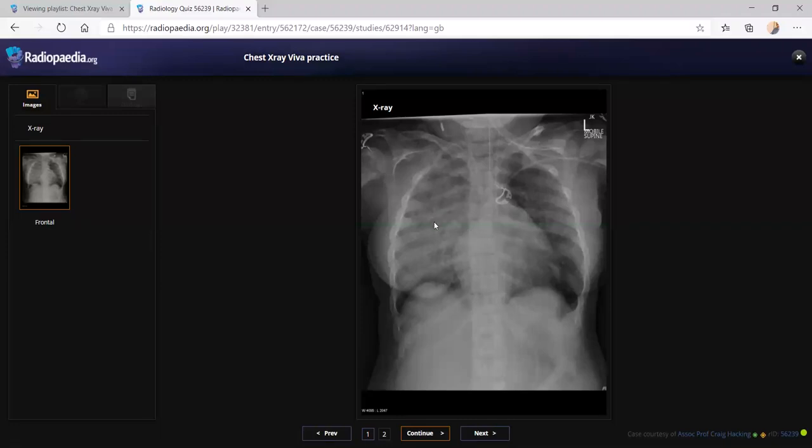So there are multiple diagnoses in this case. But you have diagnosed a cardiac disease, you have diagnosed a skeletal dysplasia, you have diagnosed a unilateral lung abnormality, maybe due to infection, maybe due to regurgitation. But you told aspiration, not cardiac regurgitation, right? No, I told cardiac regurgitation.